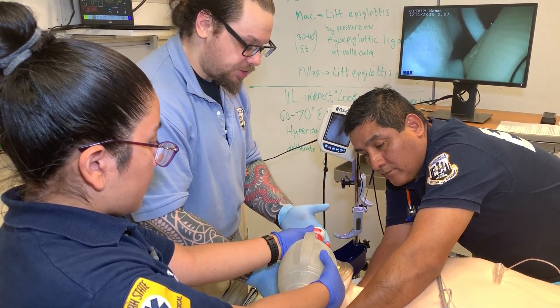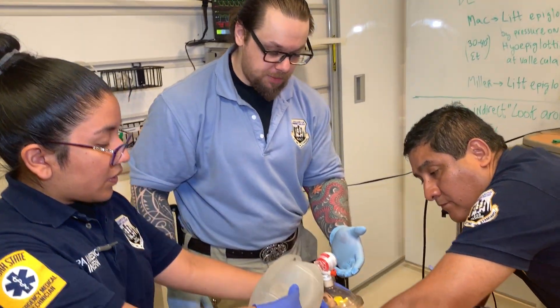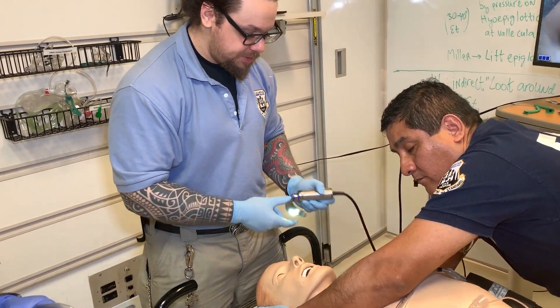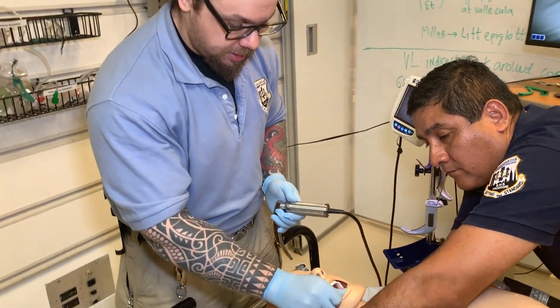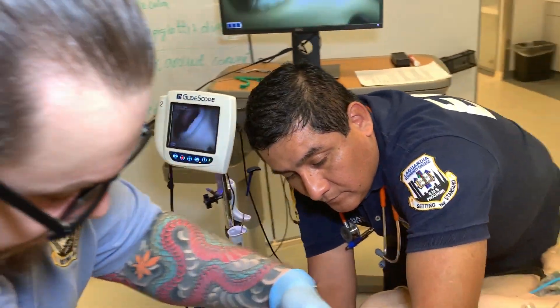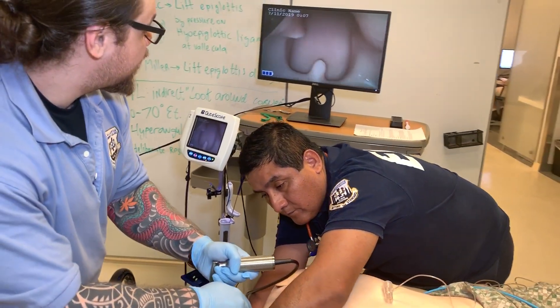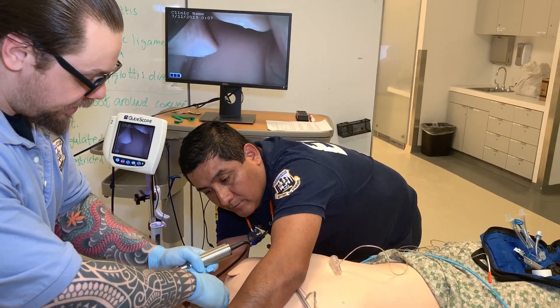Let's say we've resuscitated this person and saturation is 95 percent — now we want to perform endotracheal intubation. I'm going to remove the bag-valve mask device, remove the pre-oxygenation, and we're going to use a video laryngoscope. I'm using a cross-finger technique to open the mouth — I'm not near the teeth, I don't want them to bite me. I come in from the side with my blade to displace the tongue, advancing forward until I see the sliver of the epiglottis, then place my blade into the vallecula.